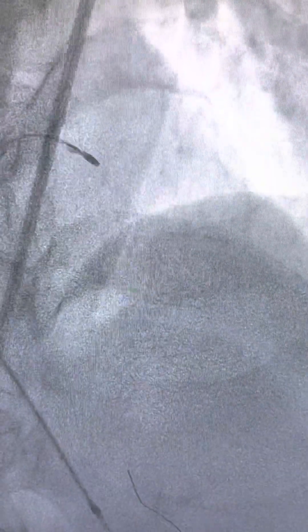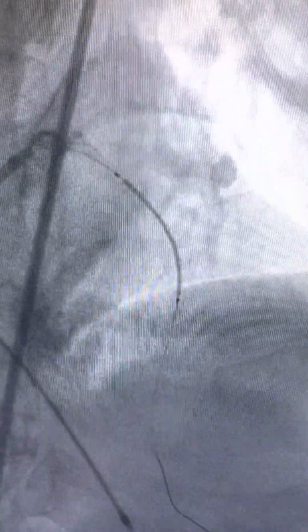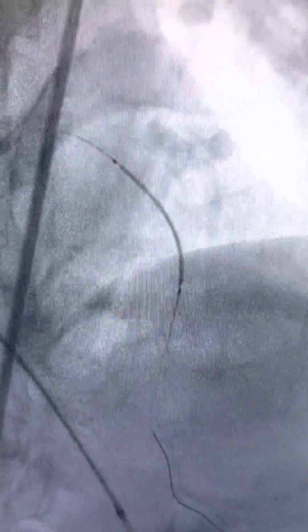When you do multiple passes of rotablation, you break all the calcium along the burr's path, and then you can easily perform angioplasty by the routine process, so your stent expansions are good.